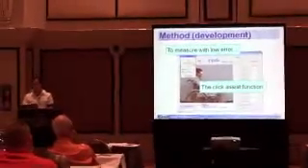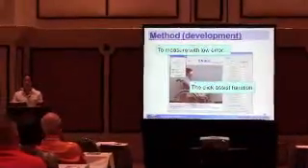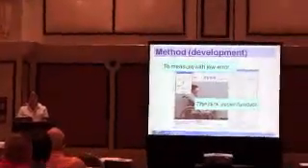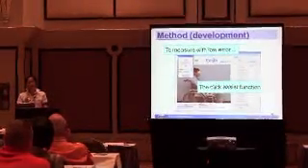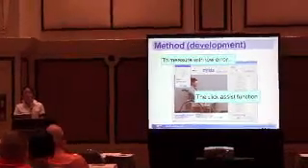If you push this button, the cursor moves one pixel by one pixel: left up, right up, left down. So you can push and identify the landmarks more correctly.